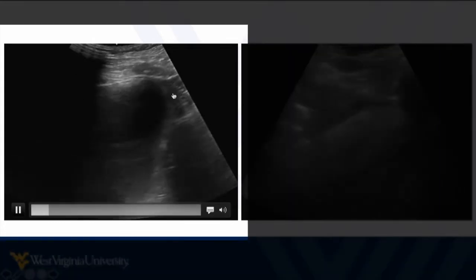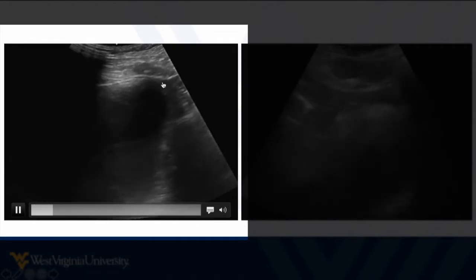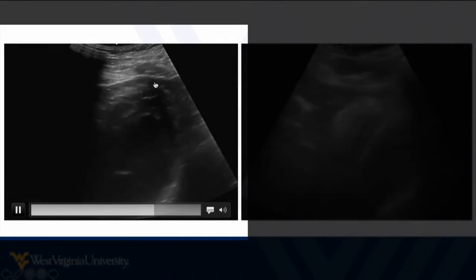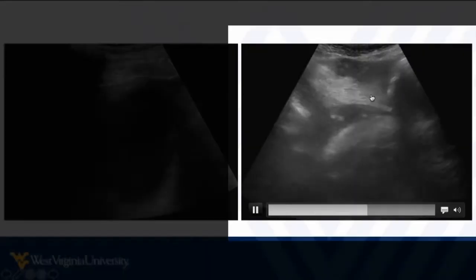This is all fat pad wrapping around, but it's not circumferential, and it's pretty much all the same shade. It gets thicker and thinner a little bit, but there's no waving. It keeps mostly the same shape. This is a fat pad.